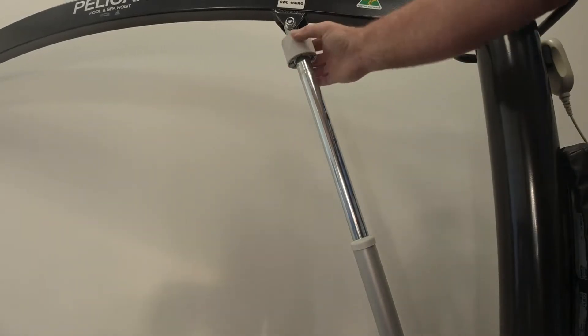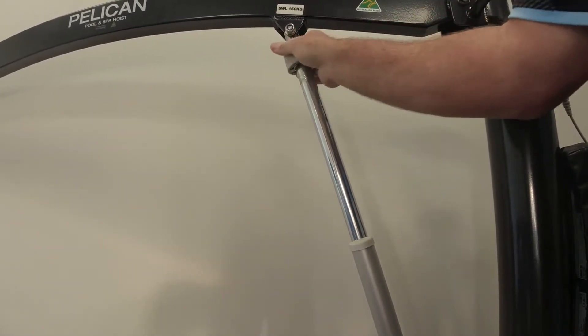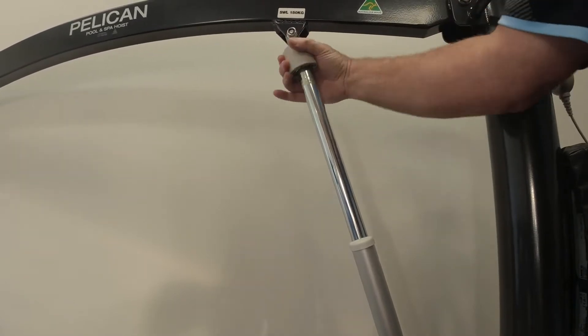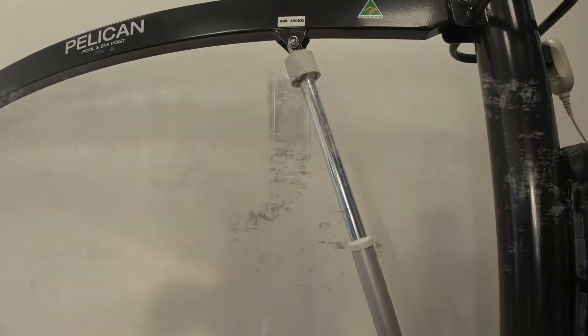If there is a failure, there is a secondary manual emergency lower which allows you to wind the plastic collar at the top of the actuator. This only activates on the downward motion.